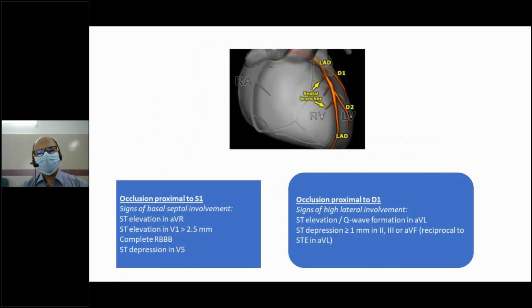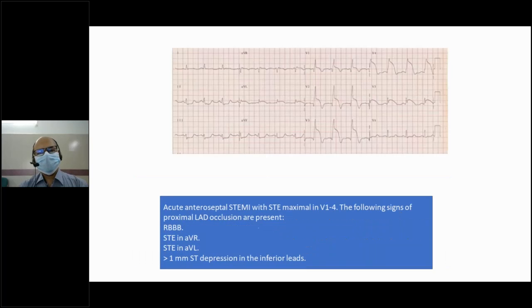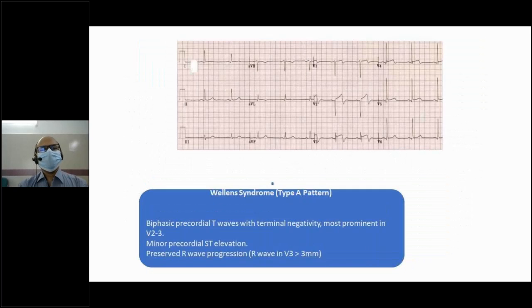This is not for you. This is coronary artery. This is another example of ST elevated MI with RBBB. This is another example. This is the pattern of ST-T abnormality in different types of ischemia as well as myocardial infarction. This is another. This is not for you.